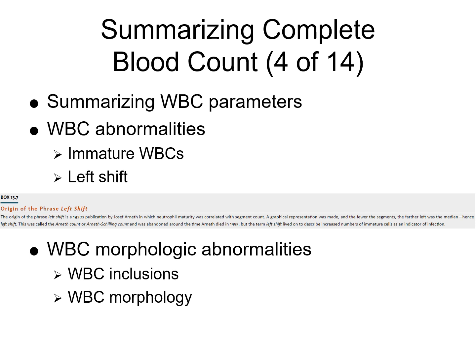White blood cell abnormalities can indicate infection, inflammation, bone marrow disorders, or hematologic malignancies. Presence of immature white blood cells, such as bands, metamyelocytes, or myelocytes, usually reflects an active bone marrow response to infection or stress, which is often described as a left shift.